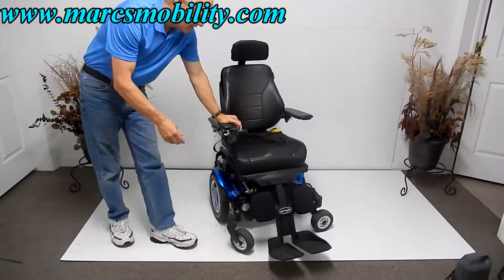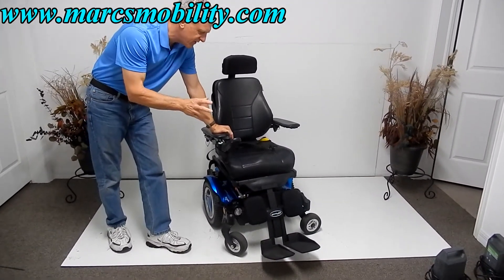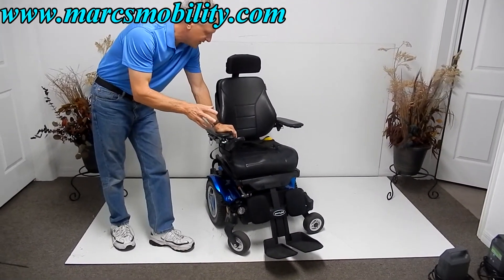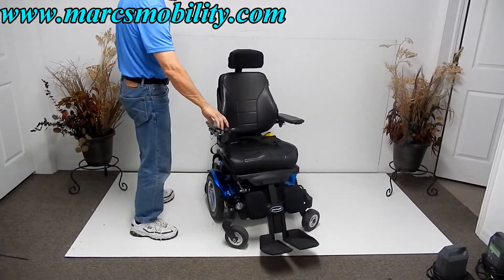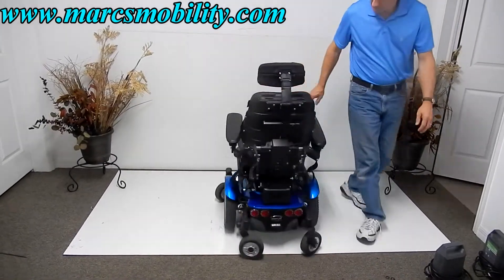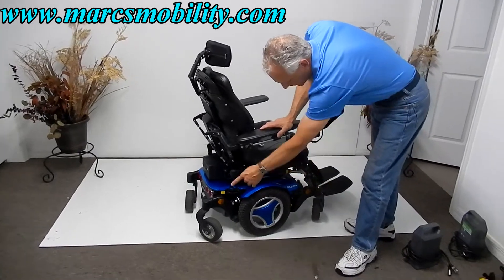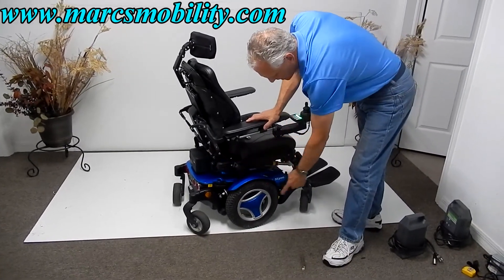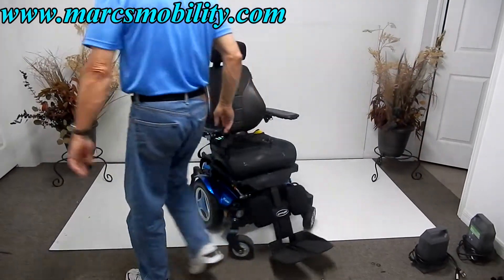This chair takes two batteries — Group 34, 60-amp batteries — which will give you about 13 to 15 miles on a battery charge. This would be your turning radius. This chair is considered a mid-wheel drive. You can see the front wheel and back wheel follow the chair, so you can turn this chair in the same position without moving.